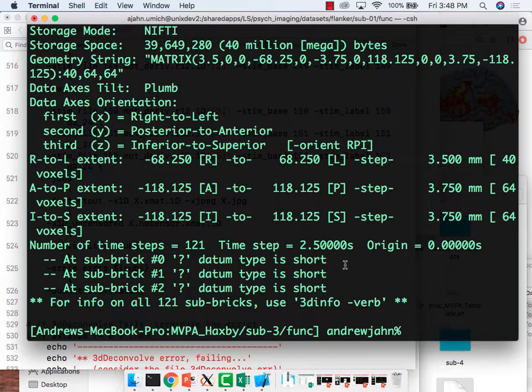You can regress just the motion. Does it do means and derivatives? Sorry? Doesn't it in 3dDeconvolve put the motion means and derivatives separately? Yeah. Actually, one set of those?